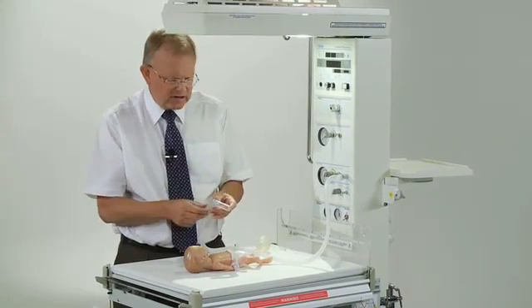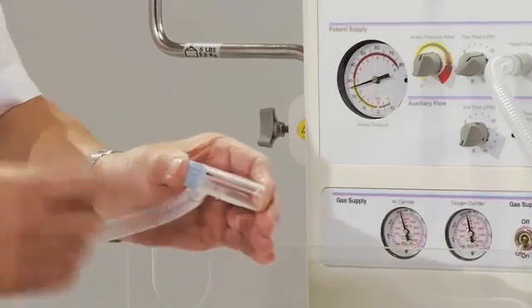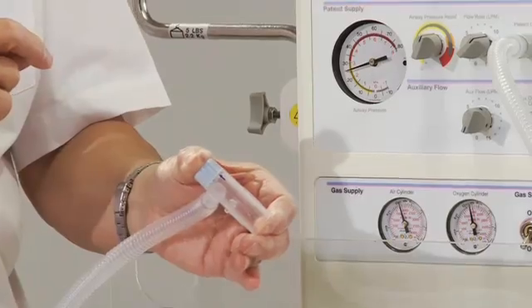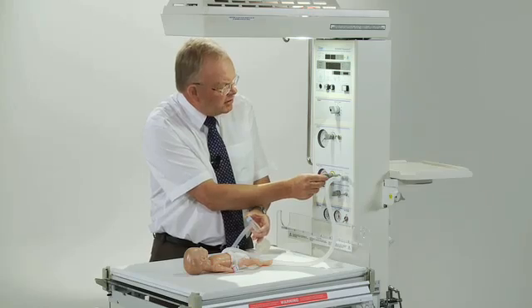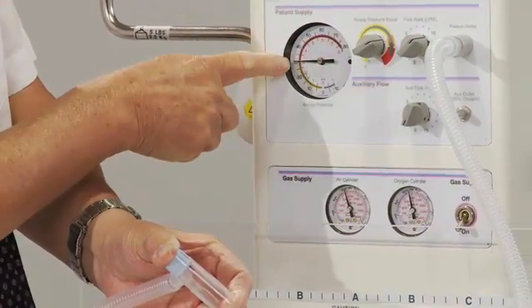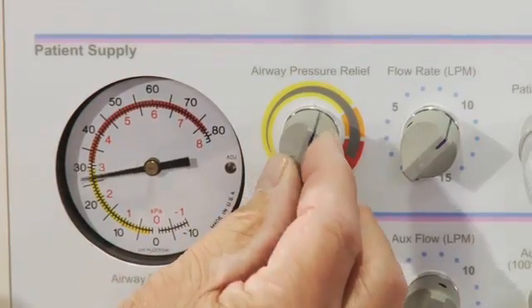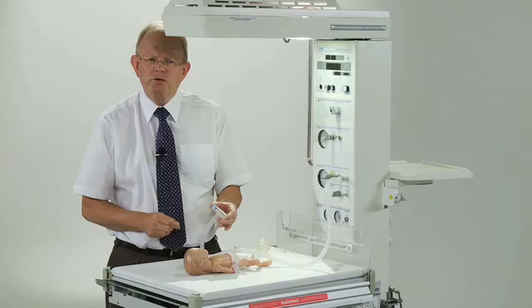Now in order to set the peak inflating pressure, I put my finger over the hole in the PEEP valve and the device is now reading a pressure of about 25 centimetres of water. I would like to set it to 30, so I'm going to turn the pressure relief valve knob until that pressure is at 30. But you might want to set it to 25 or 20 or some other pressure, and that's done by adjusting there. So now we've got the device set up for use on the baby.